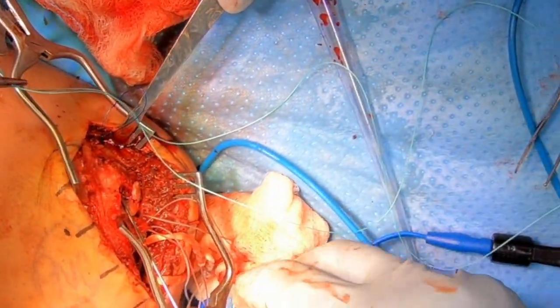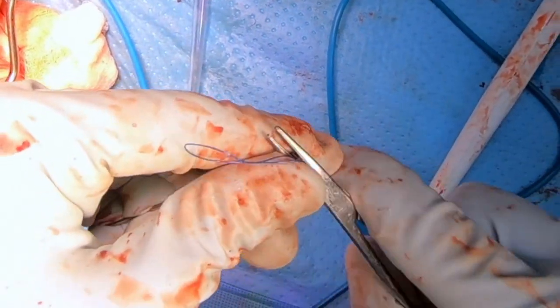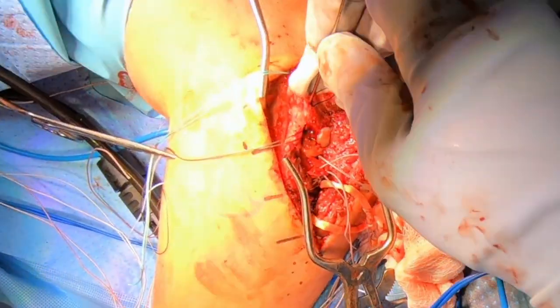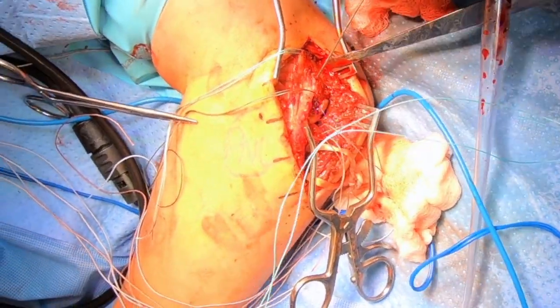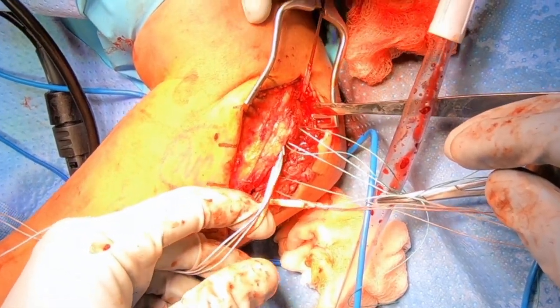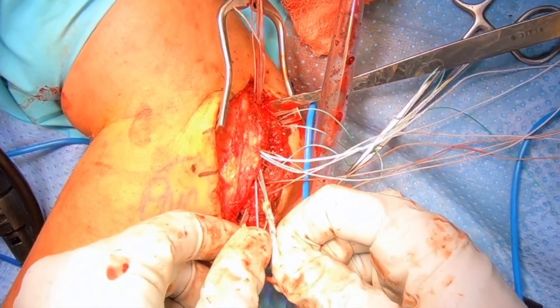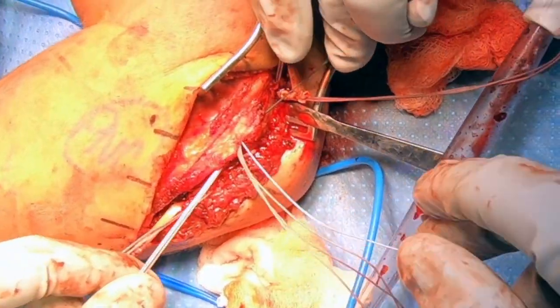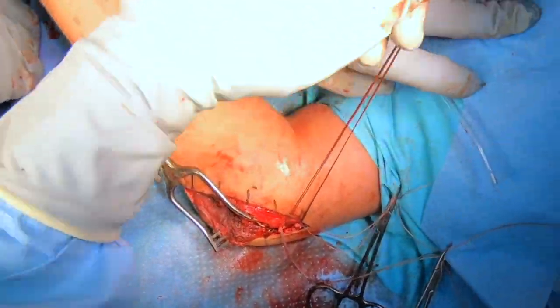I've used this as a passing suture and pull it through the tunnel I've drilled. I'll bend this little passer so that it passes through the other little Y in the tunnel, then use that to pass another passing stitch. Now I've got two passing stitches placed, my ligament repair sutures placed, and my graft placed. I use those sutures to pass my graft and ligament repair sutures through those tunnels — here passing through the back one, you can see the sutures pulling through, and then passing through the one on the side. I'll even up the ends of my graft and make sure they're pulled out the end — you can see two ends of the graft there.